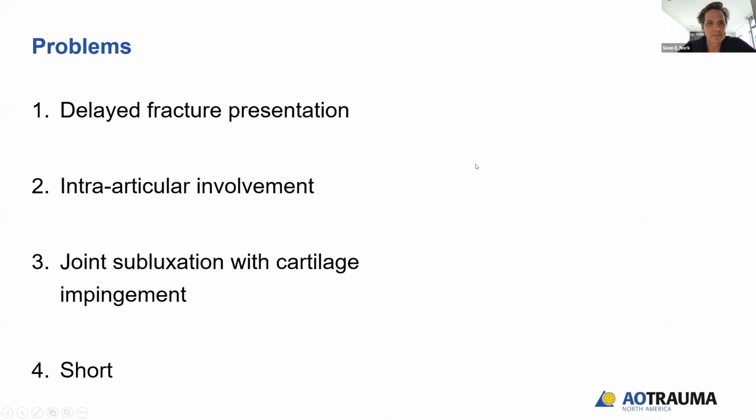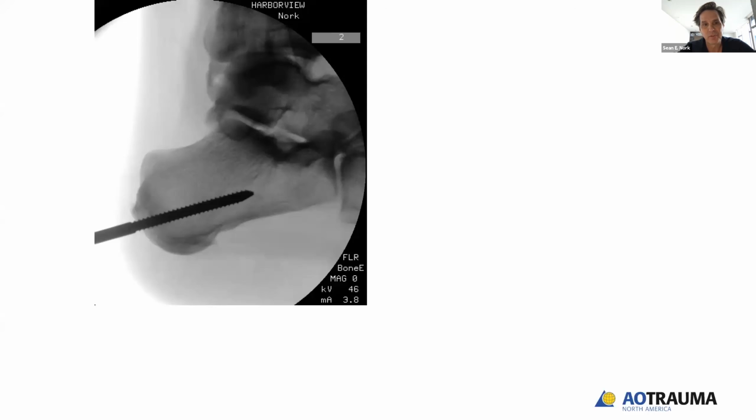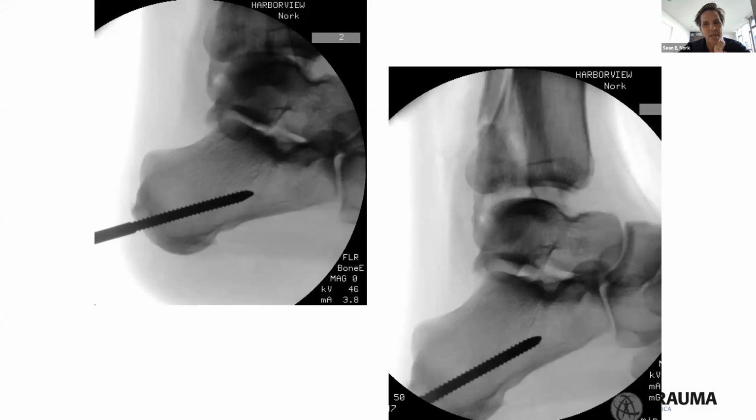So I think everyone's point was good, and the shortening turned into quite an intraoperative project in addition to trying to get callus out. And we certainly did have to recreate the original fracture with osteotomes, both through the fibula, as well as from cranial to caudal, as well as from the medial side. So we certainly started with the distractor. The second pin is through the incision directly posterior to anterior through the posterolateral approach. And we did a gastroc slide right off the bat in addition to it. But I was probably struggling more with the reduction, but we did do a percutaneous tendo Achilles lengthening.